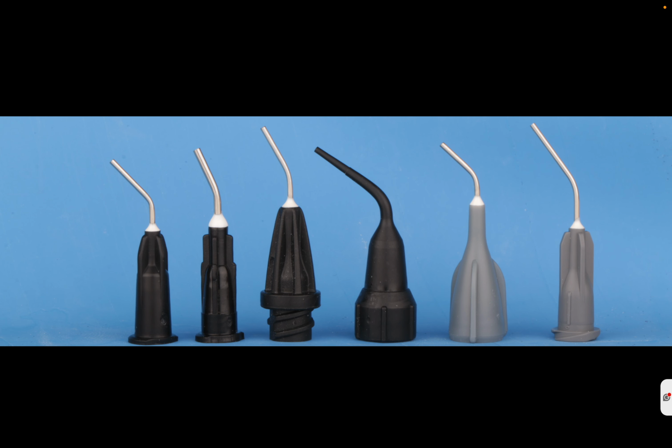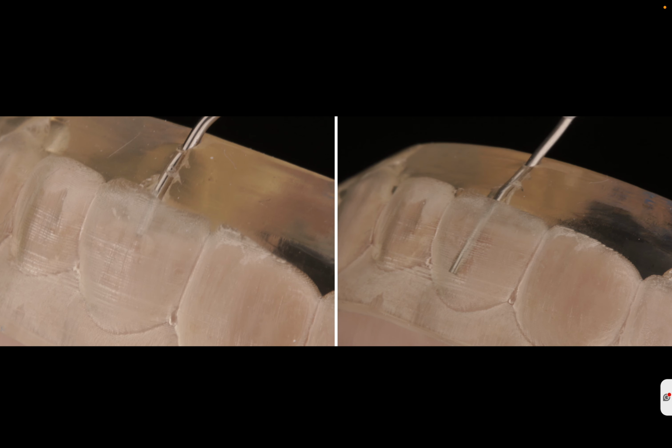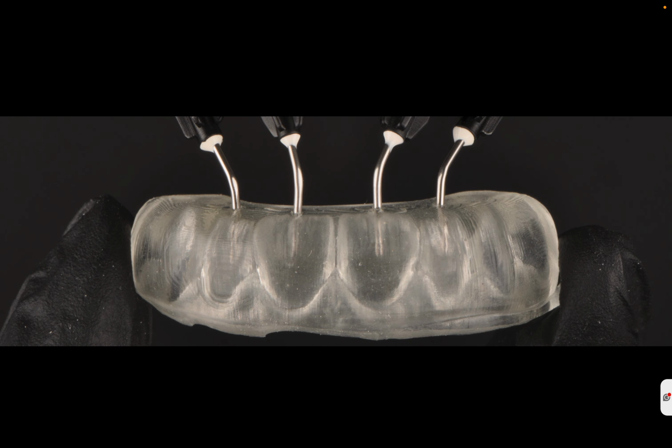Regarding the tips, I strongly recommend long tips with a metallic end, because in that part you can reach the gingival aspect and avoid having a lot of excess during the injection process. And it has to be fixed in the silicone, because if it rocks a little bit you have even more excess.